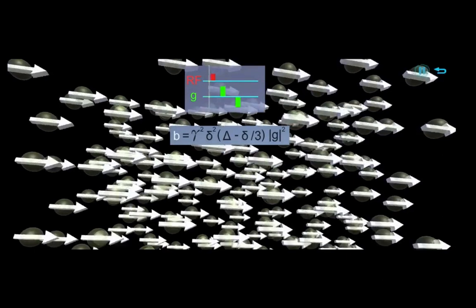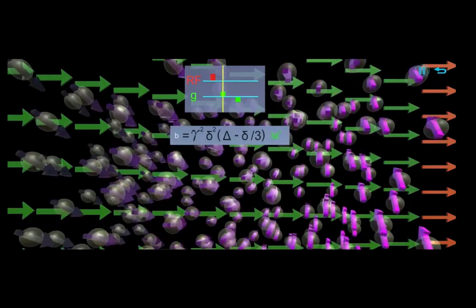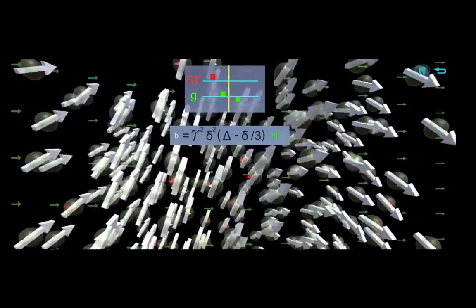Now these parameters that we can change, I'll show you how these are related to the diffusion signal that we get in this B value. So the first thing that we can change is the height of that gradient specified by G. If we made it a little bit shorter, it's going to induce less dephasing because it's not going to be as strong there as it is over there.